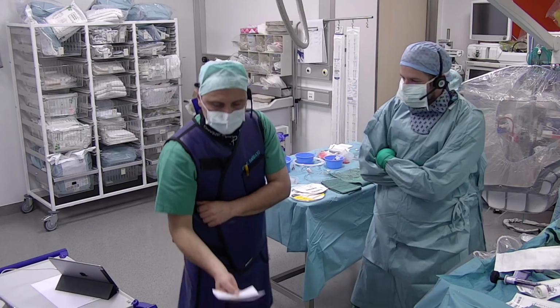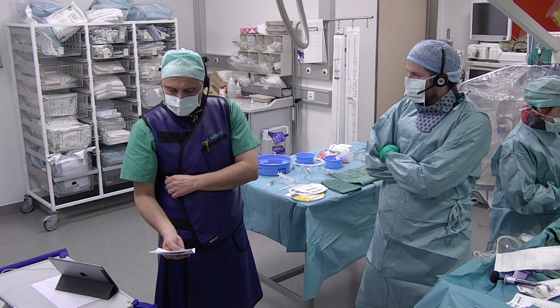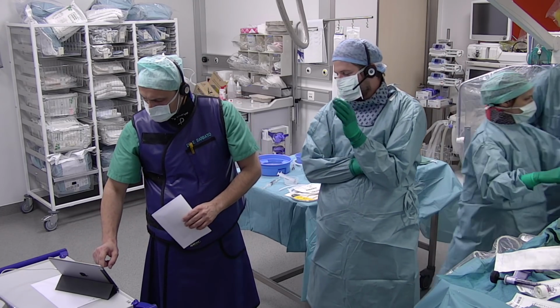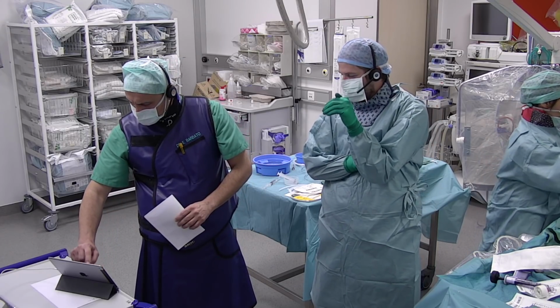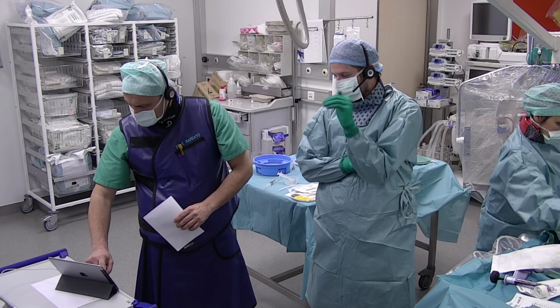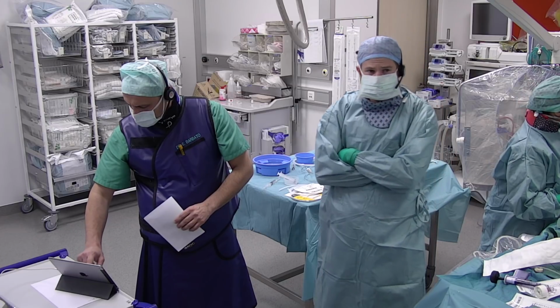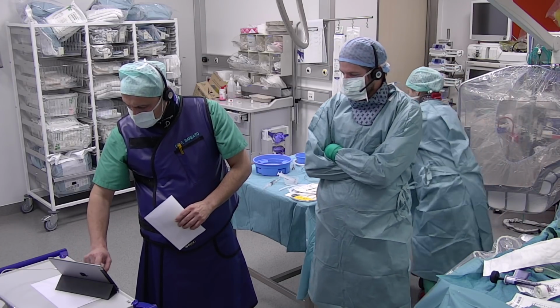In some patients, you simply cannot achieve a good projection where you can see the ostium. Then placing a wire floating in the aorta, just to leave the radiopaque marker of the third wire coming out from the guide floating in the aorta, can really nicely mark the ostium of the left main. Okay, that's another important point.